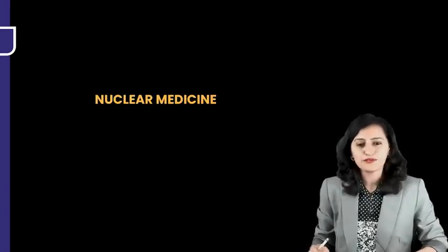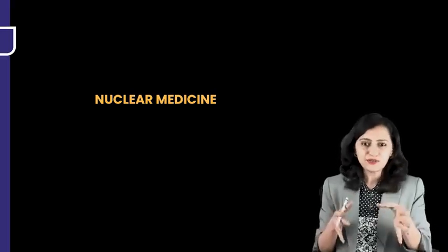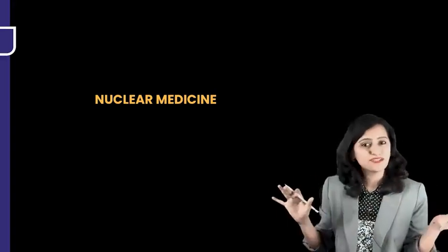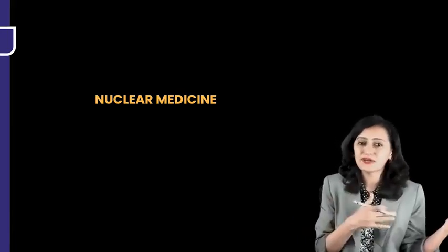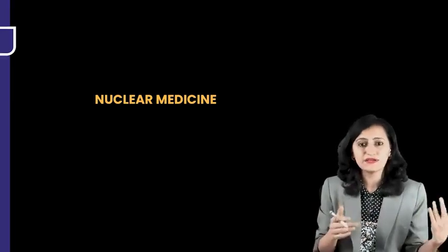Hello friends, so now we are going to learn quickly about nuclear medicine and radiotherapy. Nuclear medicine and radiotherapy are branches which are different from radiodiagnosis. You have entirely different PGs in both of them. Nuclear medicine has various modalities, like radiodiagnosis has X-ray, CT, MRI, ultrasound. Similarly, the modalities included in nuclear medicine are scintigraphy, that is the nuclear scans, the radioisotope scans. We have SPECT and we have PET.